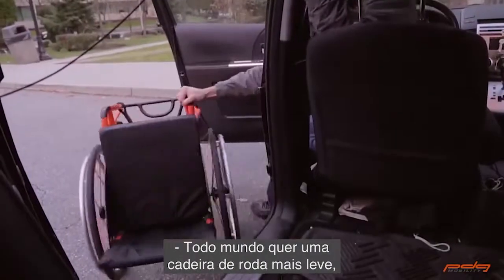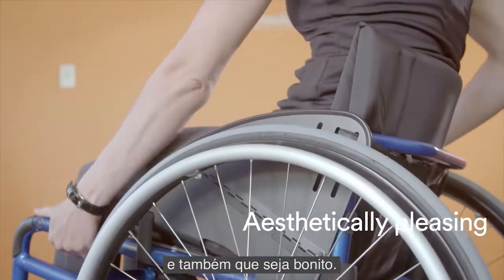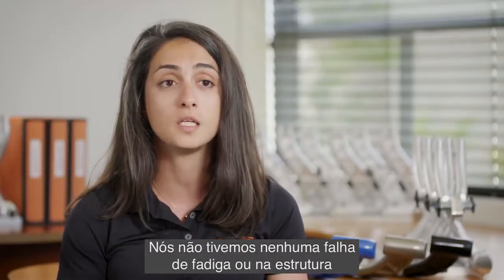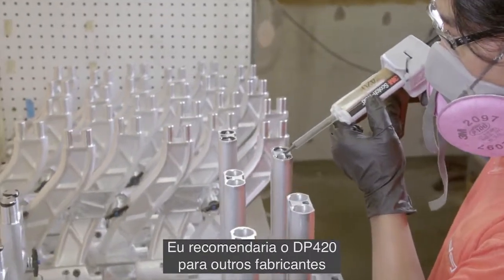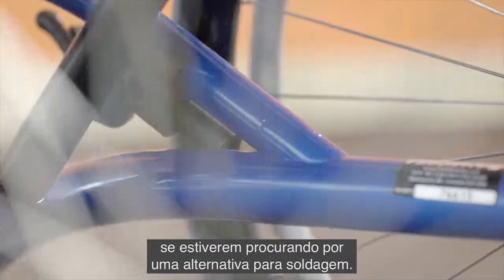Everyone wants a lighter wheelchair and everyone wants something that's easy to use as well as something that looks nice. We haven't had any fatigue failures or any frame failures since we've implemented the bonding procedure. I would recommend DP420 to other manufacturers if they're looking for an alternative to welding.